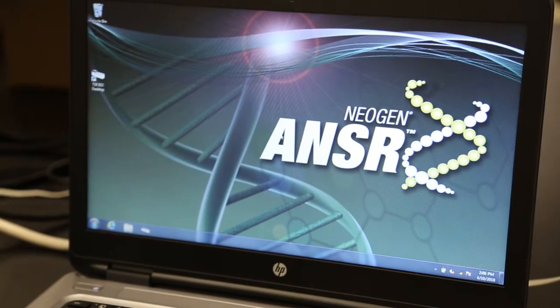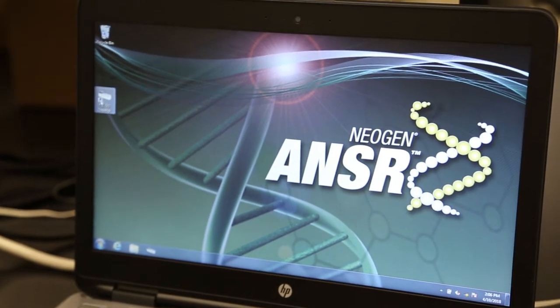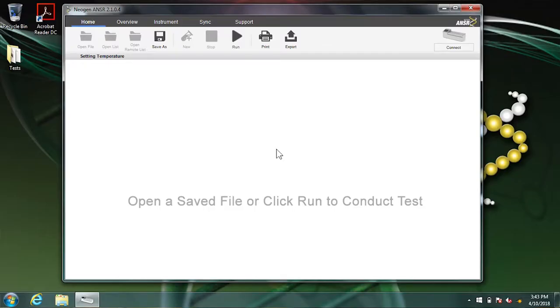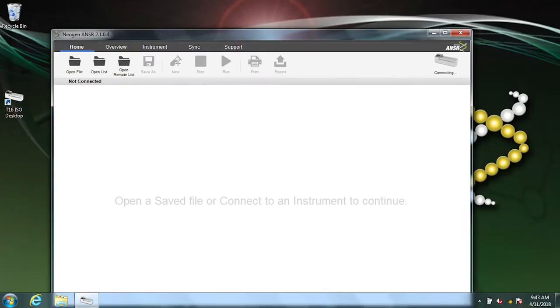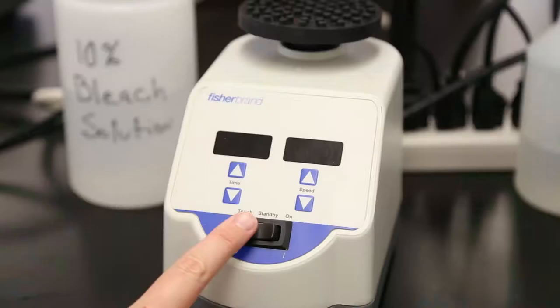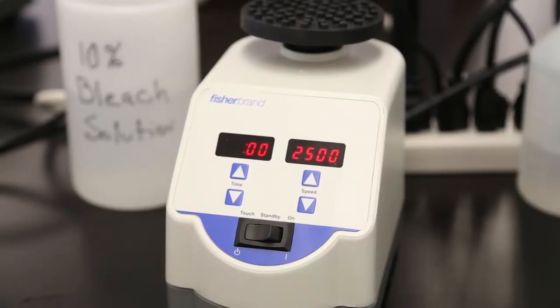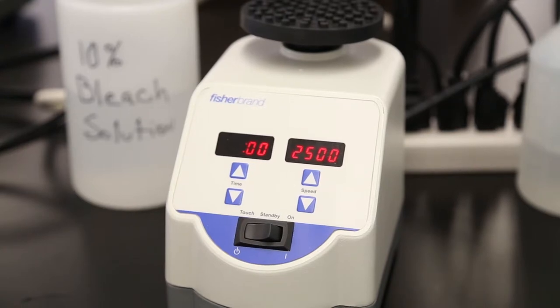Turn on the laptop and double-click the T16 ISO desktop icon. In the upper right corner, click Connect. A dialog box will appear. Click Connect next to one instrument available. It takes a moment for the computer and reader to connect. When they do, a new menu appears, as well as a green light in the upper right corner of the screen. Now, make sure that the vortex is plugged in and turned on.